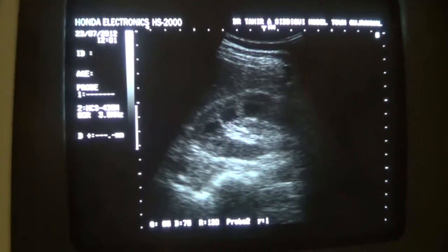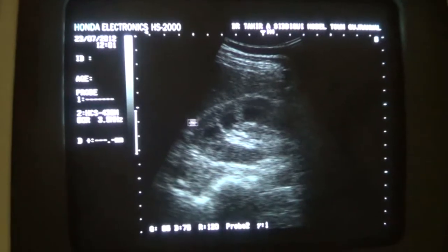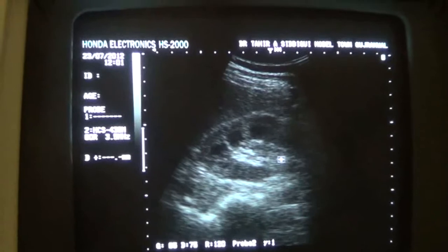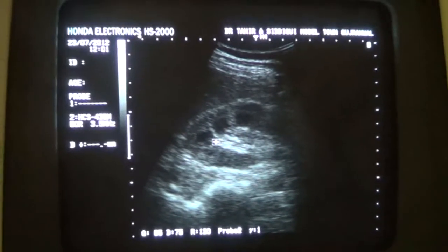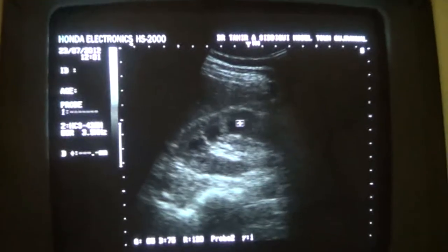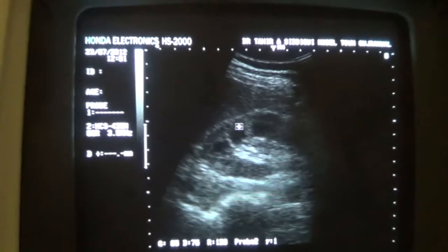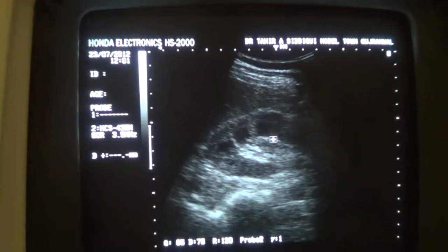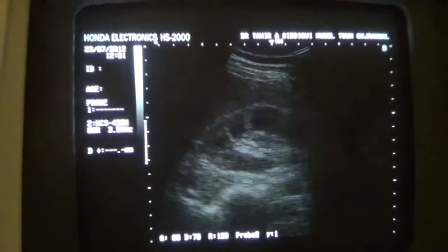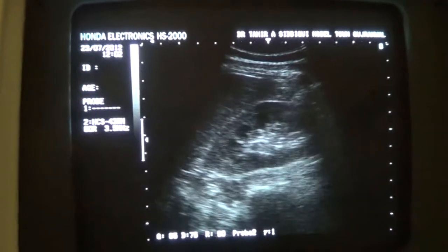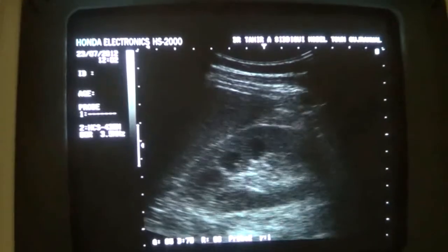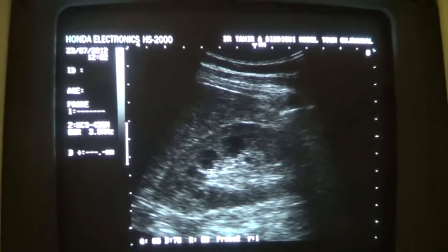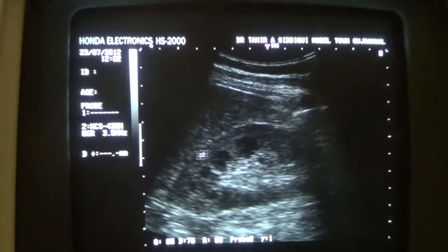Now the corticomedullary distinction is intact, thickness is normal, and there are no calculi in the collecting system or the central sinus complex. But this much prominence of the renal pyramids is significant. If you come across any such case, these are the pyramids.